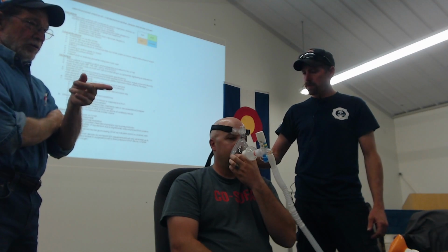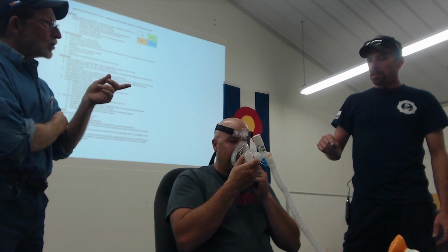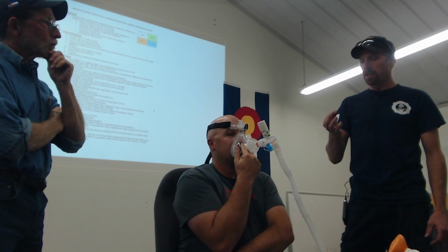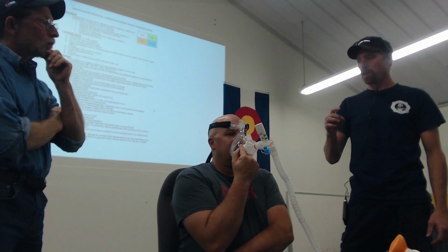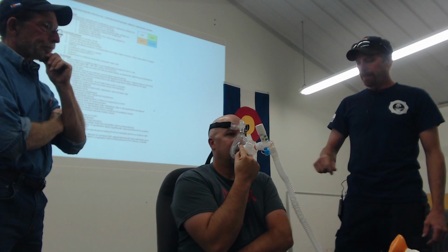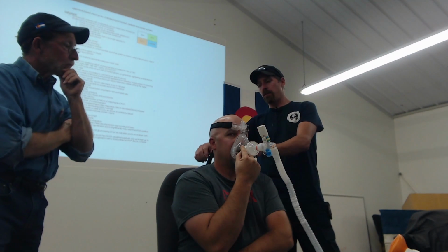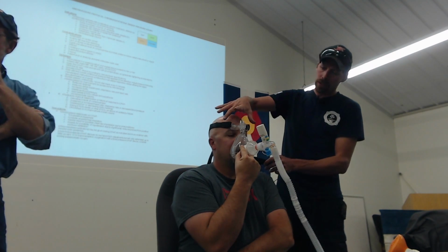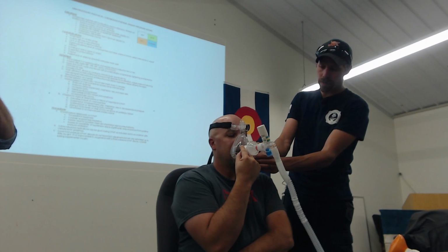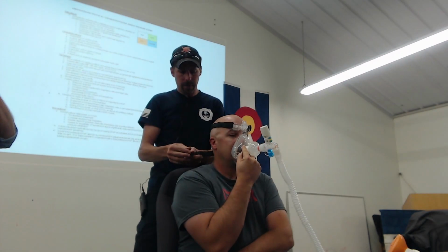And what size is this mask? Do they come in small adult, large adult? Yeah, so this is the medium, I believe, and then there's, I think, just an adult and then a large adult, if I remember correctly. So once they're tolerating that, you pull the headgear down behind their head. You can adjust these upper straps in a minute, but I would get these hooked up first, and they just snap on right here on the sides, just like that.